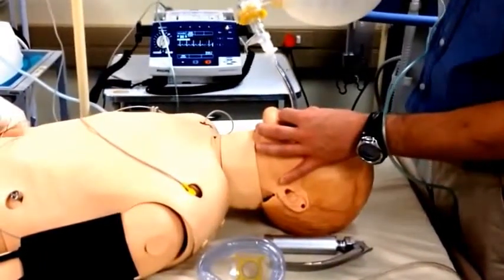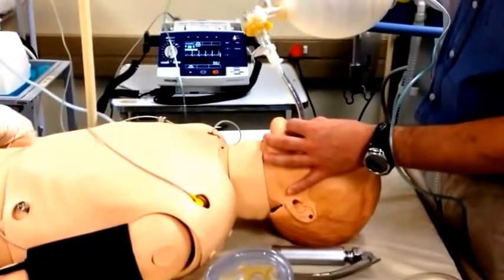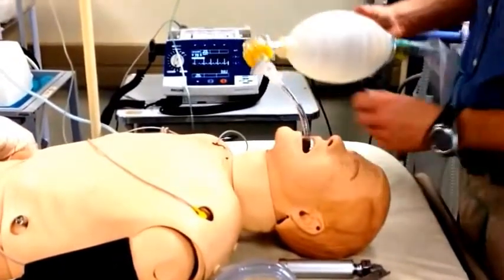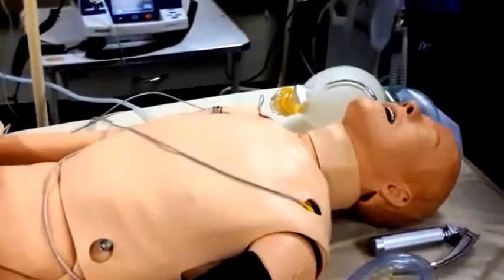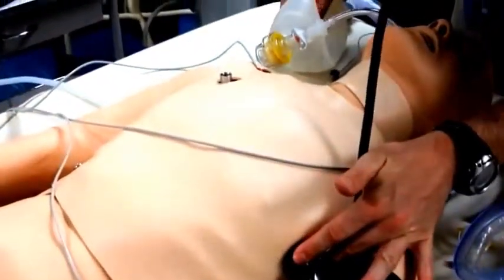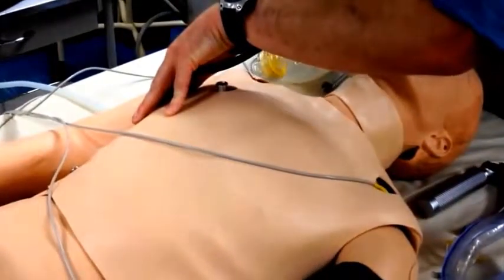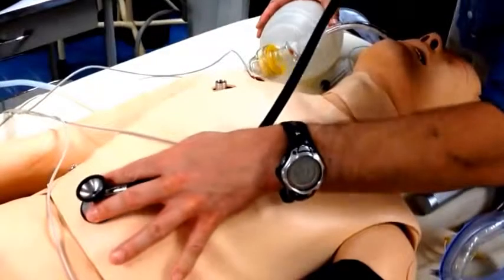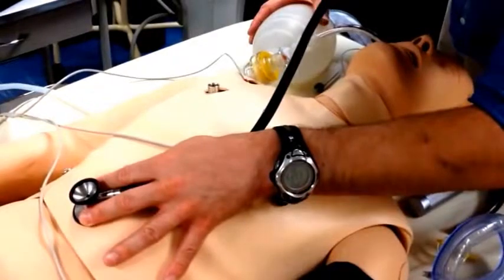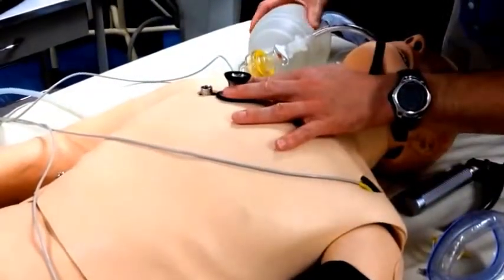For demonstration purposes, I will now let go of the tube to demonstrate 5-point auscultation. Please remember that in reality you would not do this and you would not relinquish control of the airway itself. 5-point auscultation with a stethoscope follows a sequence of the left axilla, the right axilla, listening for air entry, the epigastrium, listening for the gurgling of air bubbles that will follow on esophageal intubation, and then a final confirmation of equal air entry.